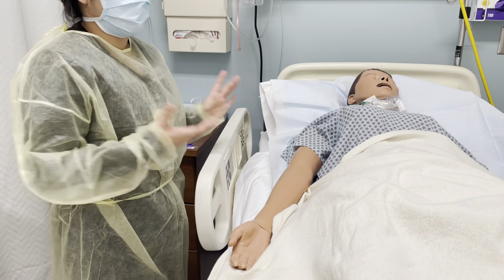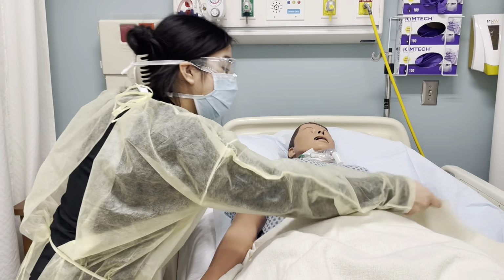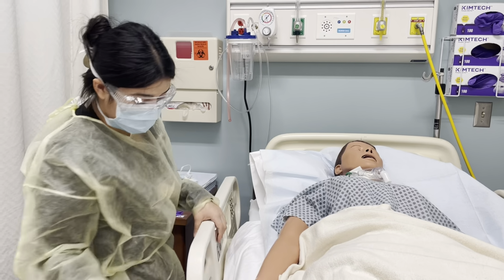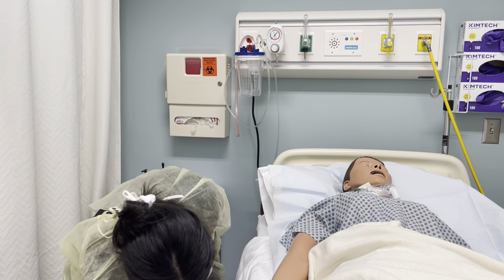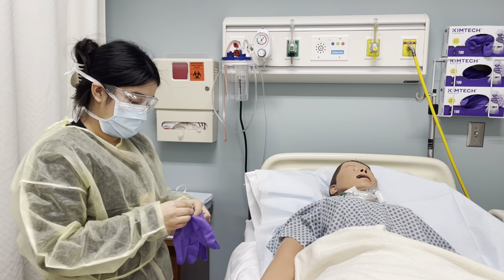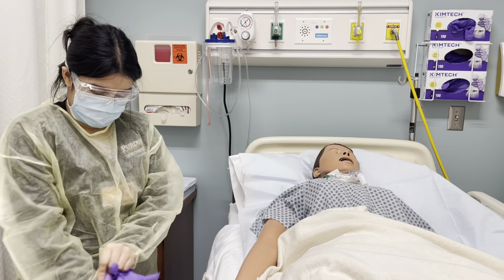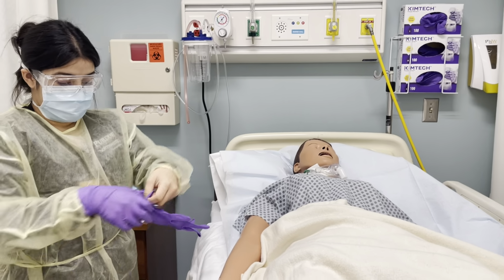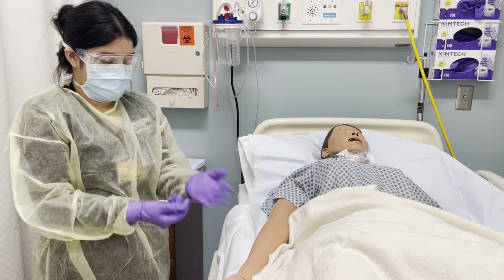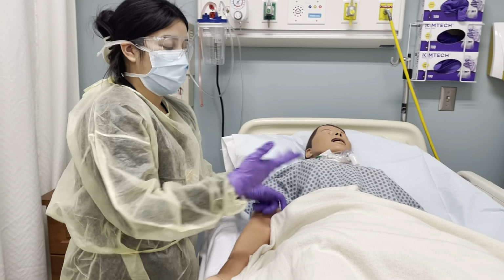I'm going to go ahead and check for any positions of tubings or drains. And there seems to be no tubings or drains. I'm going to go ahead and lower the bed rail. I'm going to go ahead and place some gloves on. And I'm going to go ahead and expose the dressing.